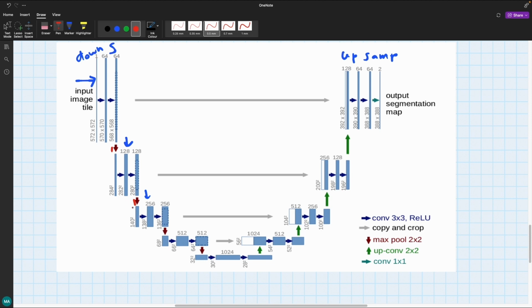A convolutional layer, followed by a max pool, and another convolutional layer, followed by a max pool, which goes in that order. This part of the network processes the most abstract representation of the input data, and it's typically where the deepest residual connections are made.